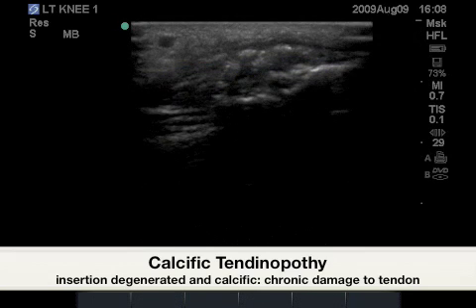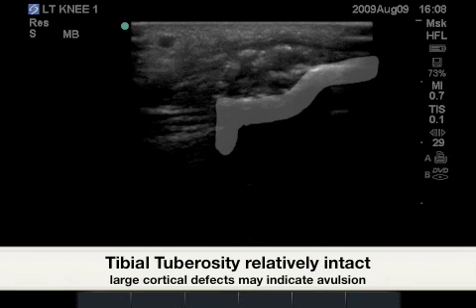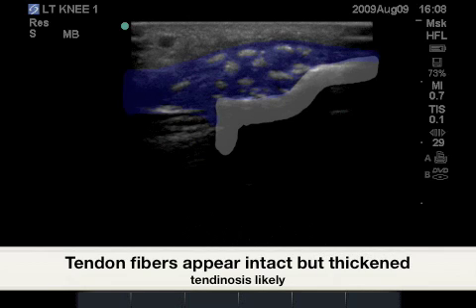In the next image, we see diffuse calcific tendinosis at the insertion of the infrapatellar tendon to the tibial tuberosity, highlighted in white. Highlighted in blue are the tendon fibers, which are infiltrated by hyperechoic shadowing calculi.